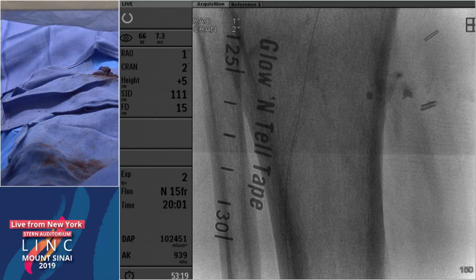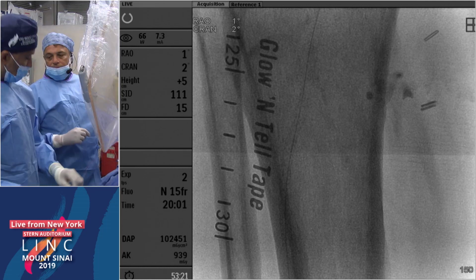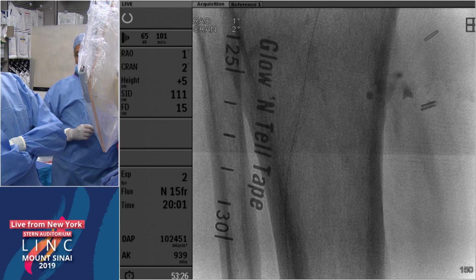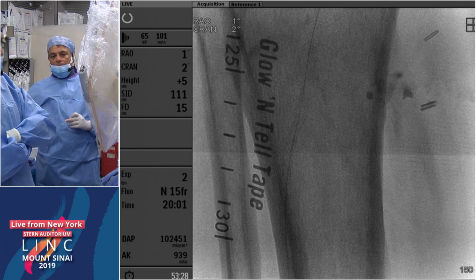I don't favor a particular stent over the other. Obviously, we know that the ongoing SAVAL trial with self-expanding drug-eluting stents in the infrapopliteal segment is ongoing right now in the United States, and we're eagerly awaiting the results. Aaron, what are your thoughts?